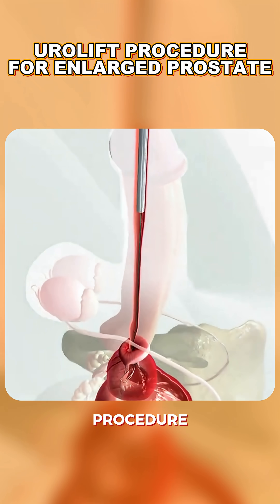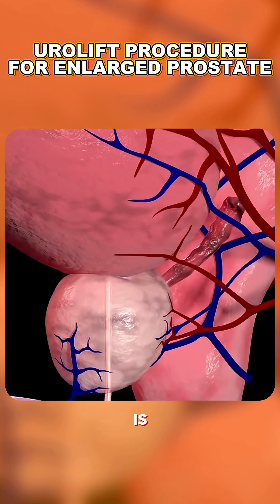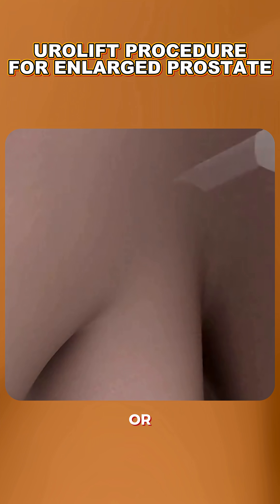Ever wondered how the Urolift procedure treats an enlarged prostate? The Urolift procedure is a minimally invasive way to relieve symptoms of benign prostatic hyperplasia, or BPH, without cutting or removing tissue.